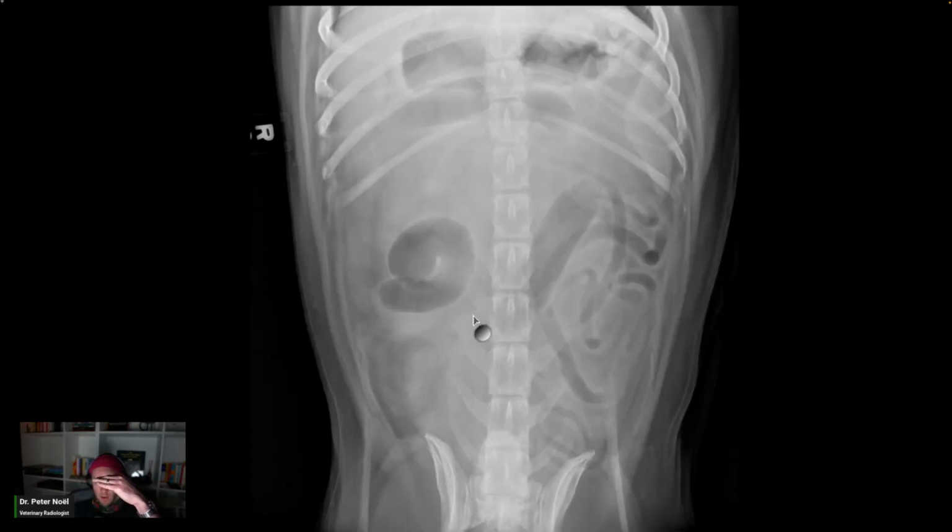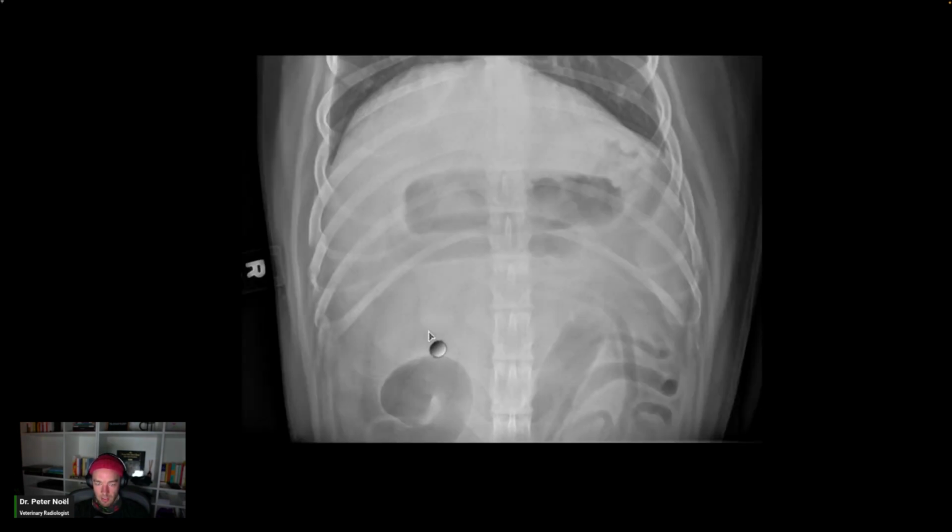The cecum, gas filled in the dog, not usually gas filled in a cat. L2, 5, right of midline. So cecum is gas, maybe a little bit of fluid. The ascending colon is probably fluid filled, transverse fluid and gas. Descending, I kind of lose it. Maybe it does this. Okay, but so then the rest of this is small intestine.